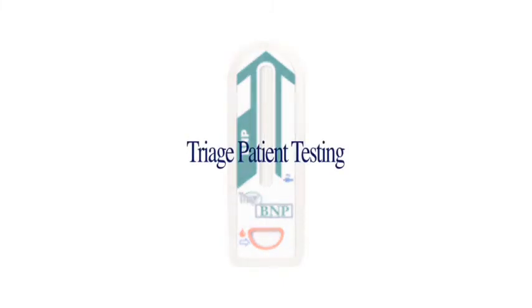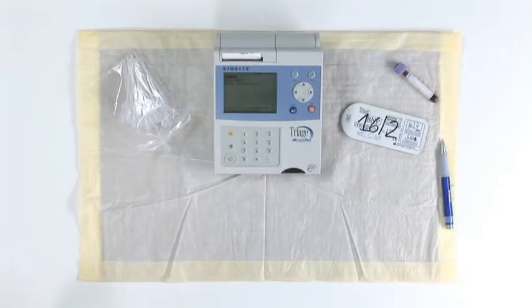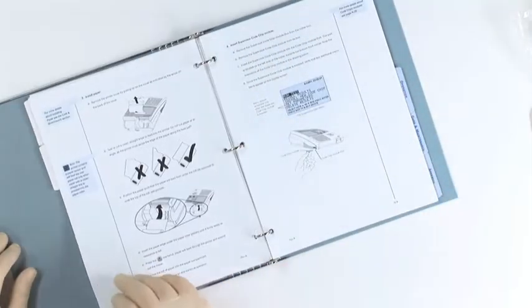Triage patient testing. When you're ready to begin patient testing, make sure that your Triage test devices are at room temperature. You can refer to the section on device handling if you have any questions.